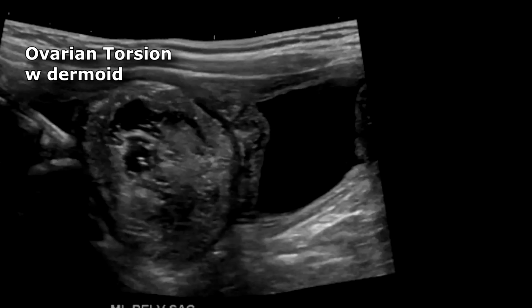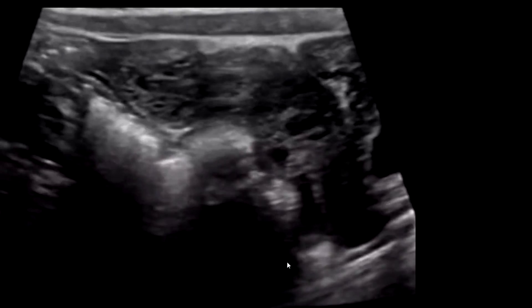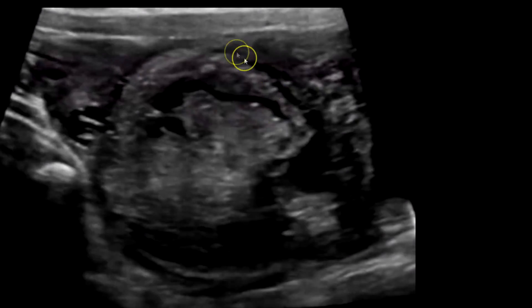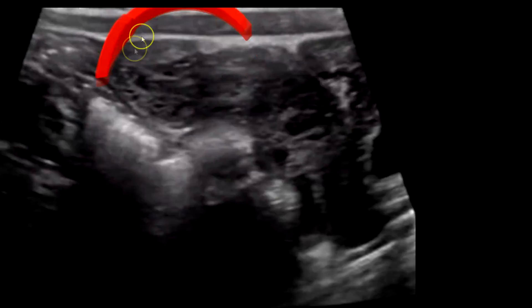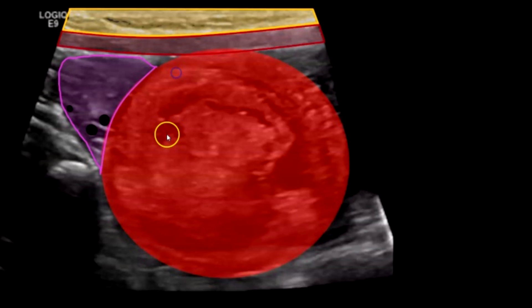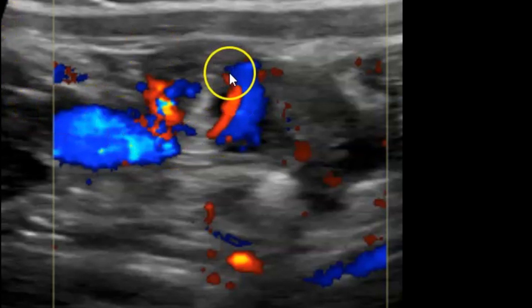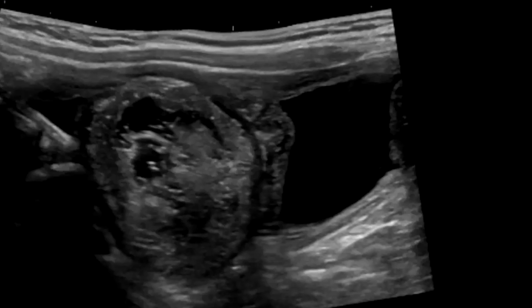Here's another example of ovarian torsion, this one caused by a large ovarian mass which turned out to be a dermoid or teratoma. A clip going through the lesion shows a bit of ovary and the dermoid, and you can see the volvulus of the adnexa — that's where the twisting and torsion occur. In the labeled image, the ovary with little follicles is shown in purple, along with the dermoid, the rectus abdominis muscle, and the subcutaneous adipose tissue. With color Doppler, you can see the volvulus of the adnexa with the classic whirlpool sign.